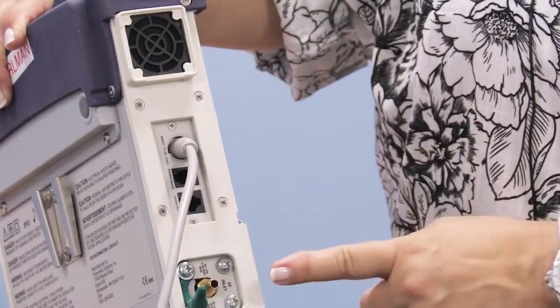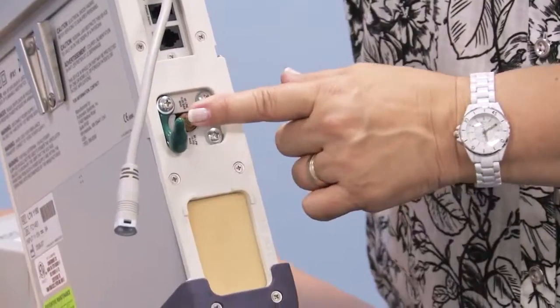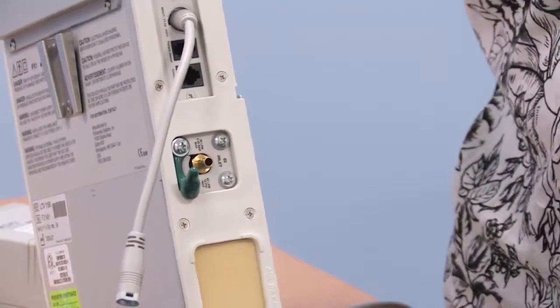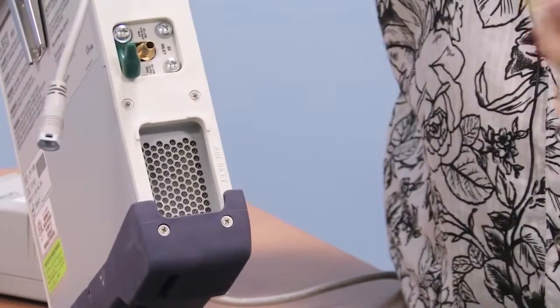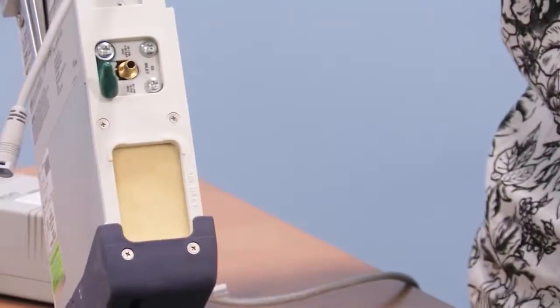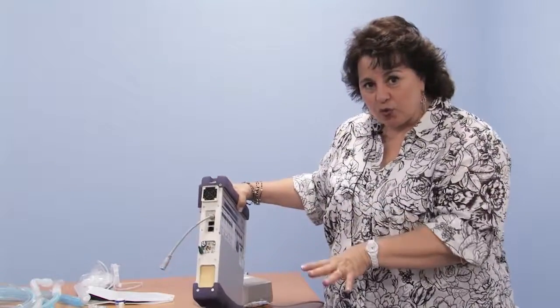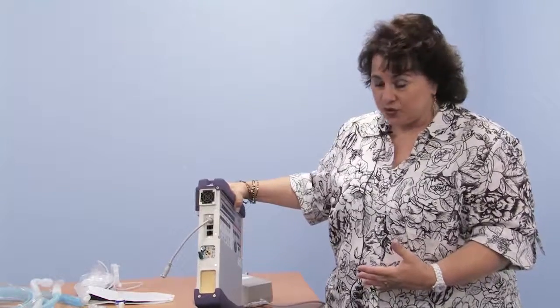This is our oxygen connector, thus the green cap. This is where we will connect an oxygen hose and give the ventilator liters per minute of oxygen based on your child's prescription and need for oxygen. This is another filter that filters the air for the air inlet. This machine is its own air compressor. It makes its own air under power. So if your child is not receiving oxygen, the machine can run without an additional source other than electricity. It will make powered air and deliver the breaths to your child.